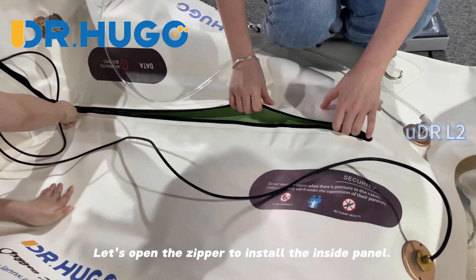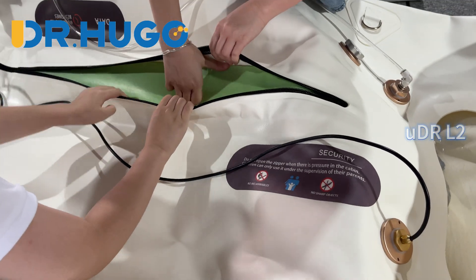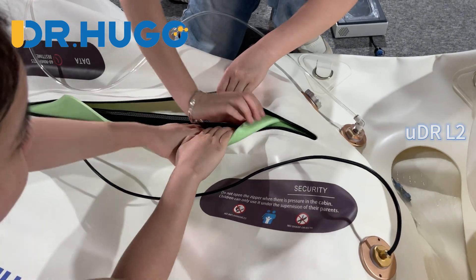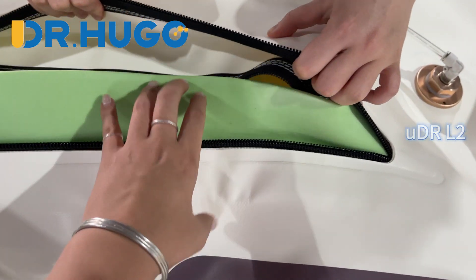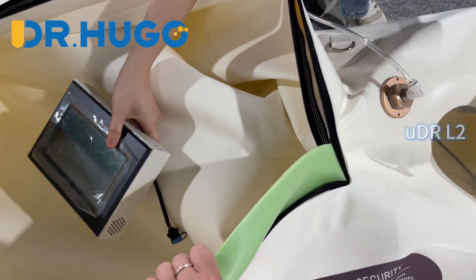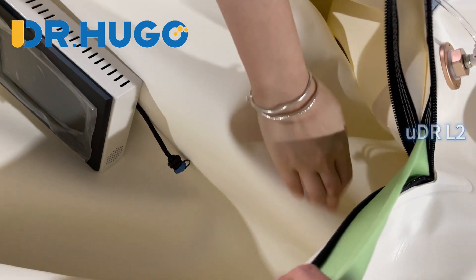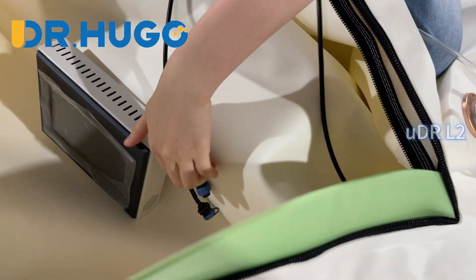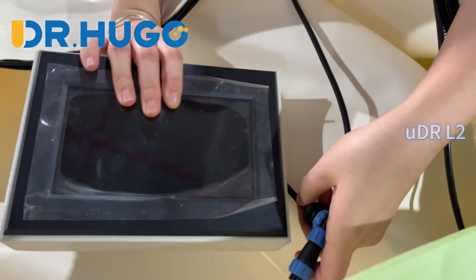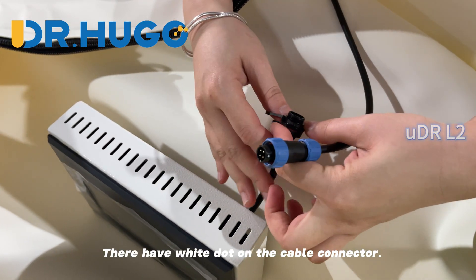Let's open the zipper to install the inside panel. This is our inside control panel. There are white dots on the cable connector.